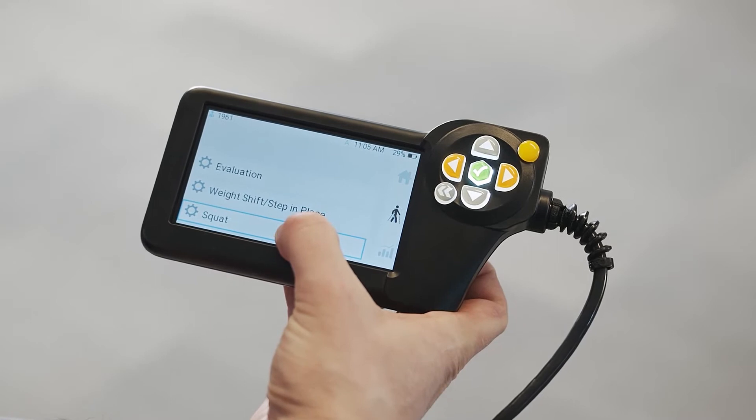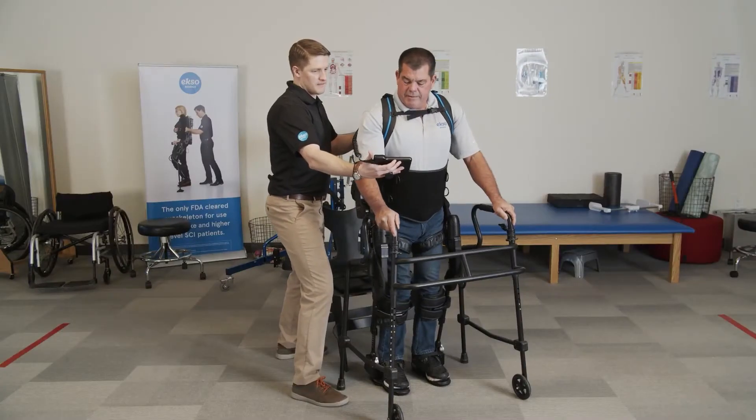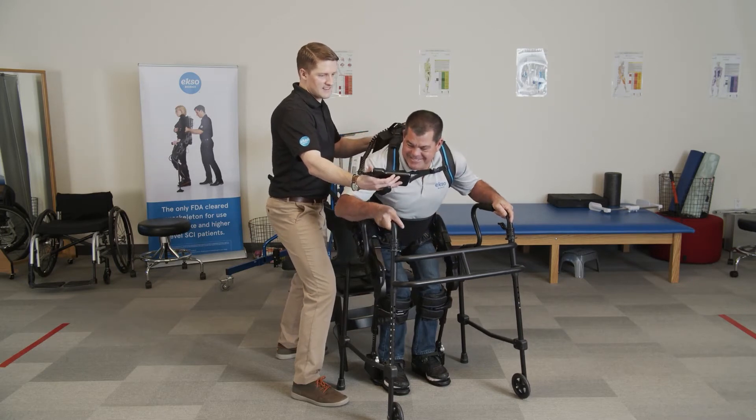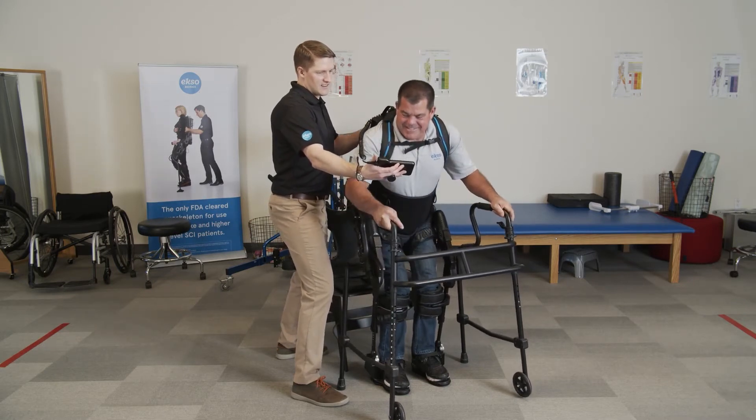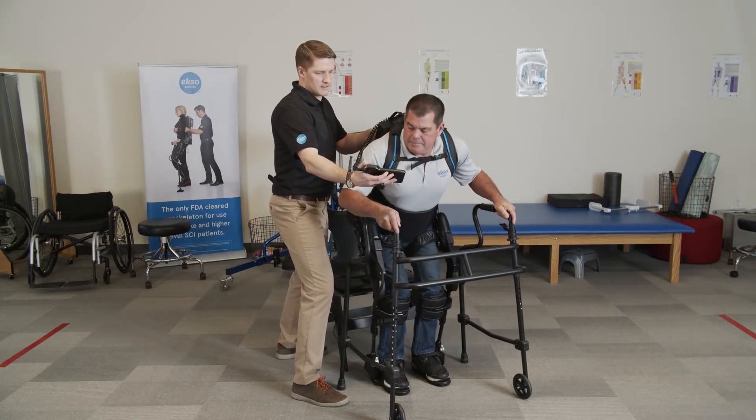Squats are performed with the legs free as well. The patient is able to squat down to a set knee flexion of either 45, 65, or 90 degrees. If the patient gets fatigued or stuck, there is a rescue button that will bring the patient back up to standing.